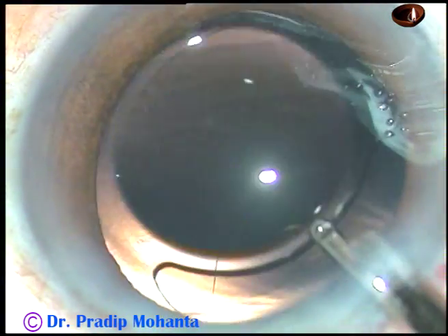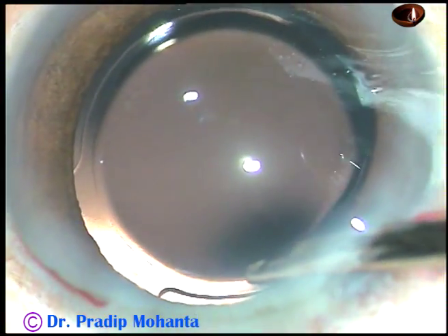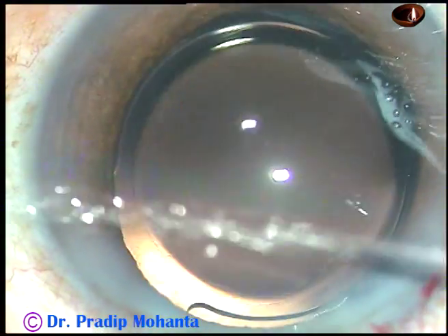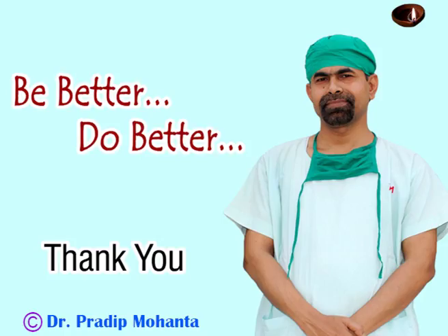That's it. The anterior chamber is formed and the case is concluded. Thank you very much for watching. Hope this video will help you in developing your surgical skills and doing very good service to mankind.